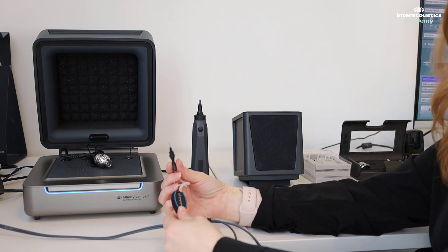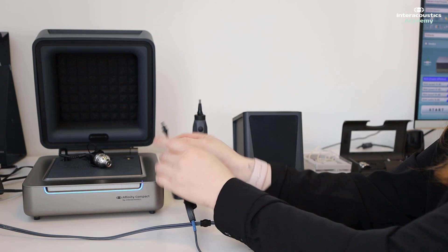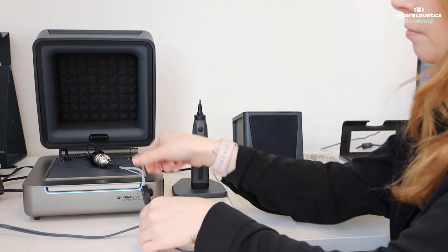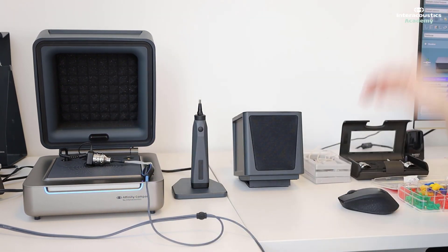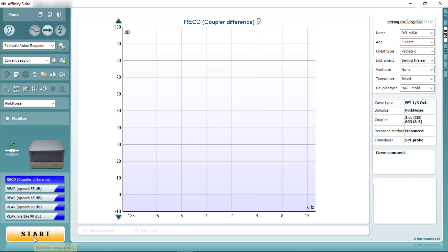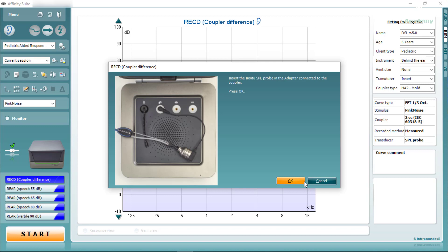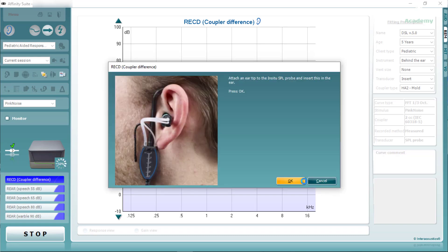Now we're ready to perform the coupler portion of the RECD measurement. We need to place this inside the coupler like so, and we are ready to press start. On the Affinity screen it talks you through the steps with images to show how to get everything set up. And that's the coupler portion of the RECD measurement complete. Now we're ready to bring our patient in and perform the ear portion of the measurement.